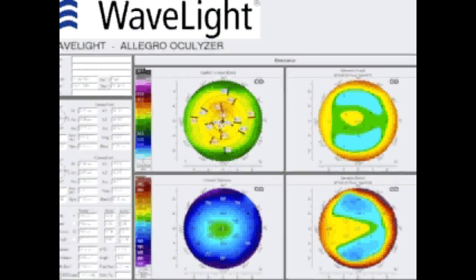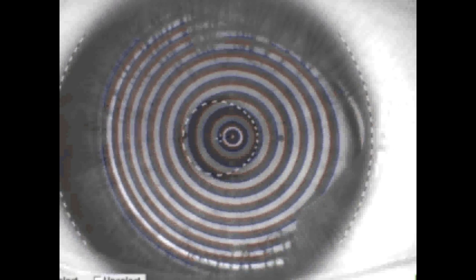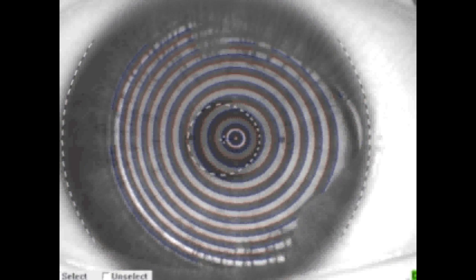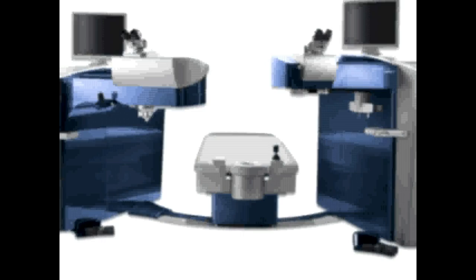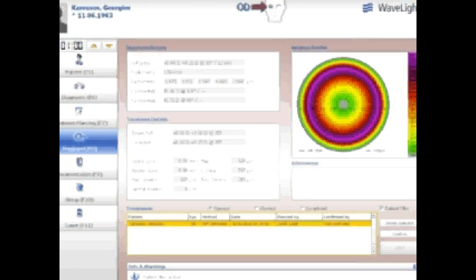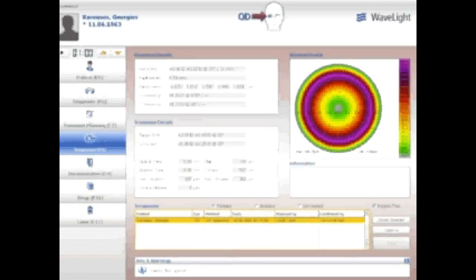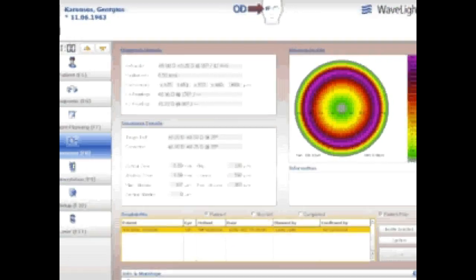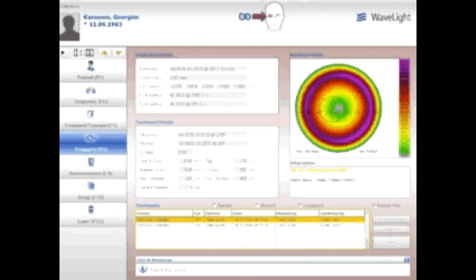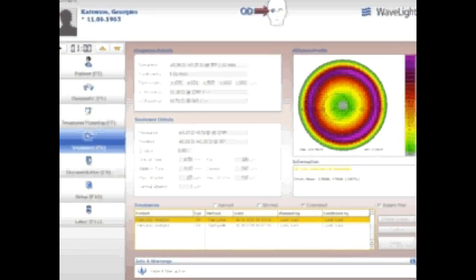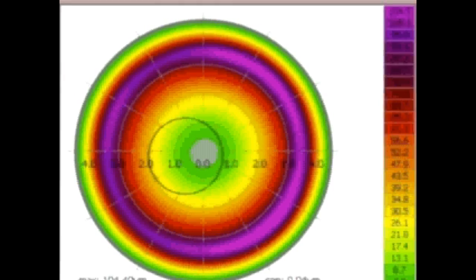This is an example of a high hyperope on the Pentacam — normal cornea — but if you study the Placido disc images you can see that the pupillary aperture is eccentric to the visual axis. Clearly the visual axis is skewed nasally on this right eye. We're using the Refractive Suite: the FS200 femto on the left, the EX500 on the right. Here is a standard hyperopic correction treatment plan. You can see how on the right eye, topography-guided, the ablation is clearly de-centered and placed on the visual axis of the patient.